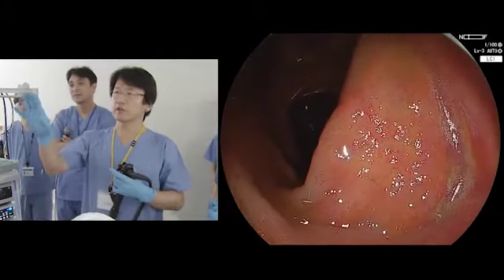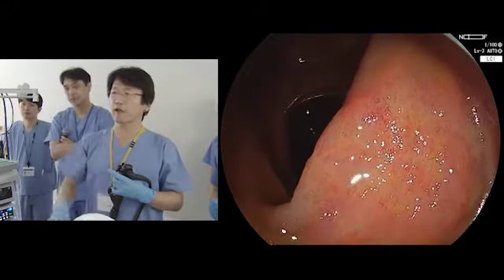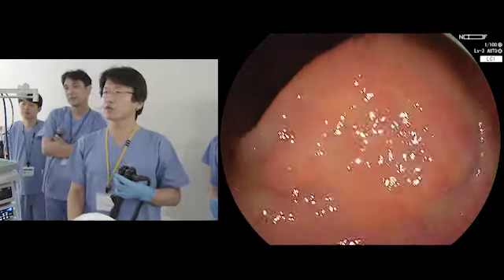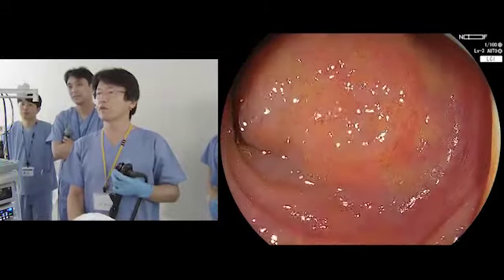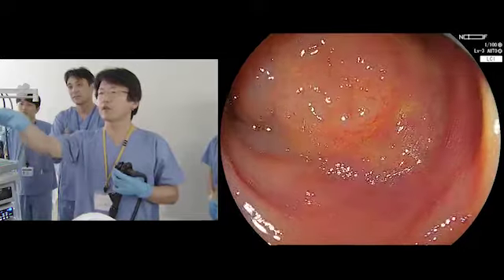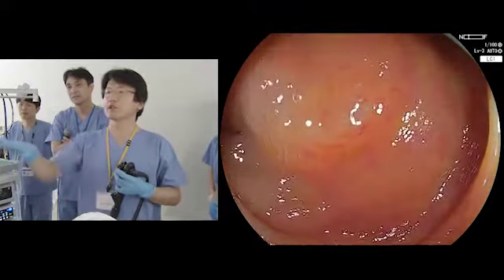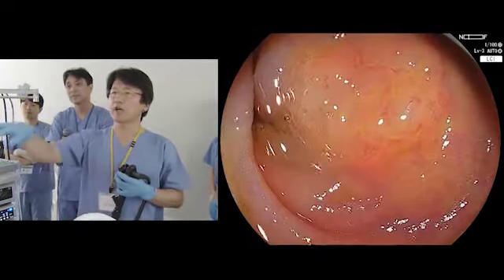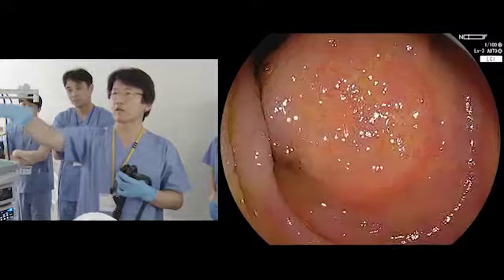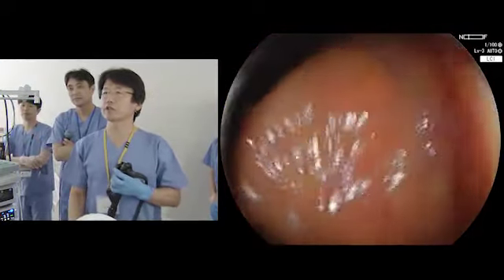As you can see, the approaching angle to the lesion is almost vertical. But what I will do is create a pocket from this level and go into the submucosal space, and then hopefully I can go up the fold and dissect below the lesion.